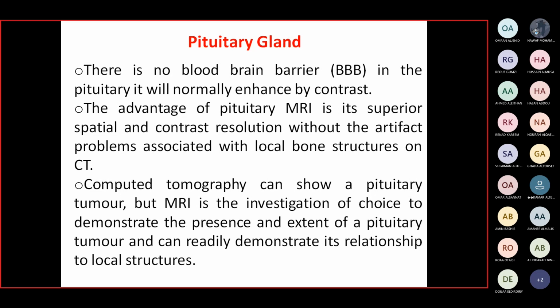This makes the contrast enhance the pituitary gland normally. So the pituitary gland is enhanced by the contrast circulating in the blood, taking up the contrast normally. MRI is the imaging modality of choice for diagnosing pituitary gland disease.